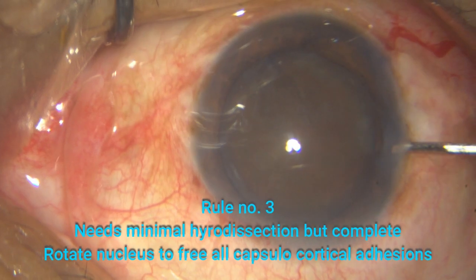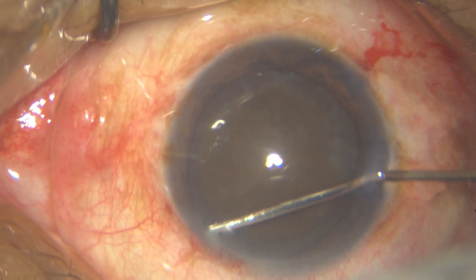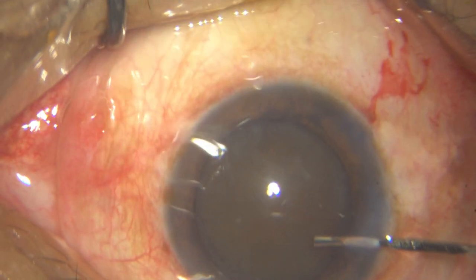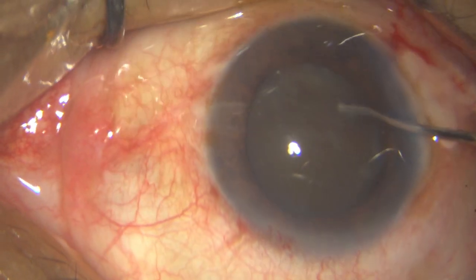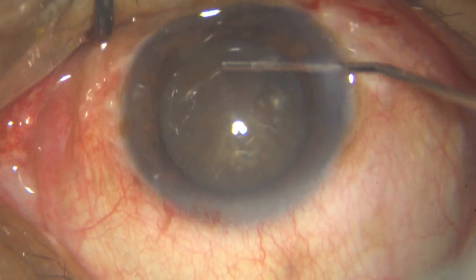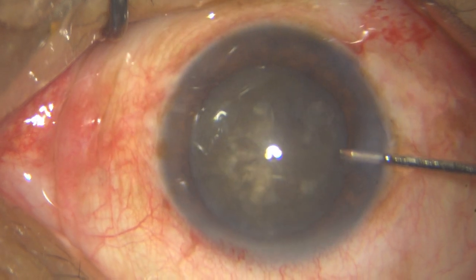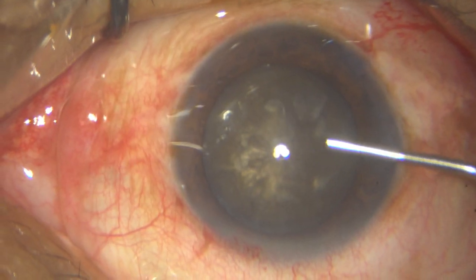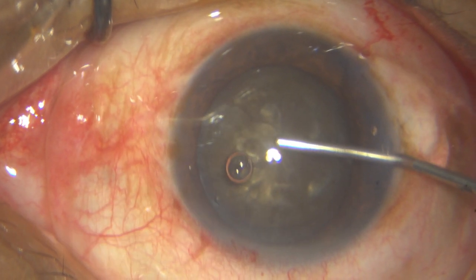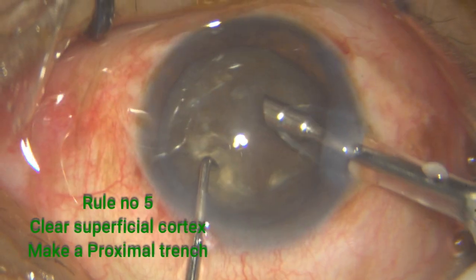So once I have done my rhexis, the next rule is you need to do an adequate, but very minimal hydrodissection in these cases. But once you have done the hydrodissection, you look for that forward movement, decompress, and make sure you rotate that nucleus either with your dialer or with the same hydrodissection tip. Doesn't matter, but rotate it adequately so that you separate all the capsulocortical adhesions. And always use the soft shell technique. Use both dispersive and cohesive OVD, and the idea is to protect the endothelium.